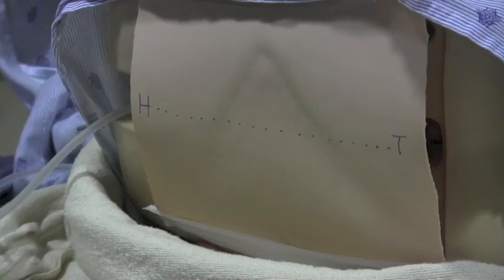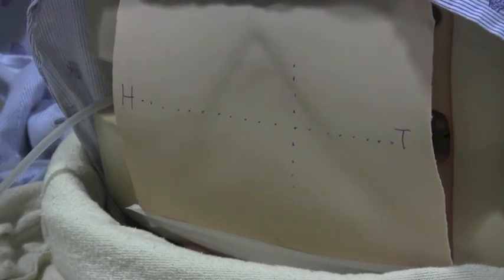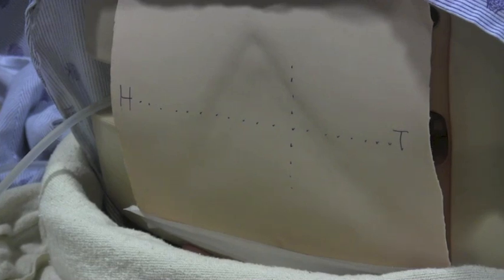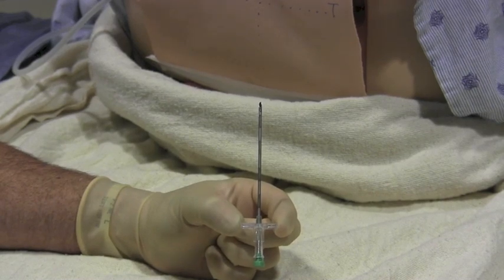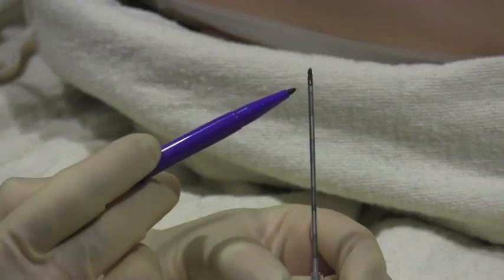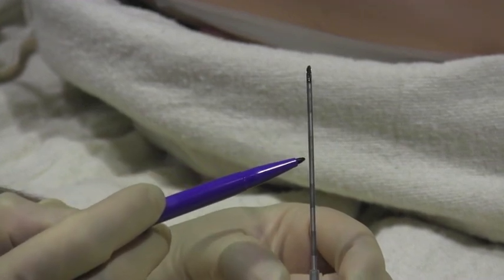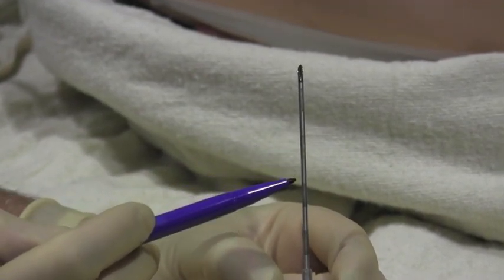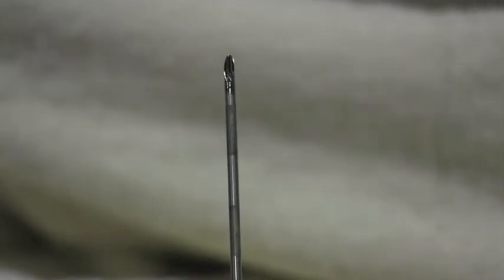Here's the back, marked head and tail, and the midline with dotted lines. The crosshair is at the L4-5 or L5-S1 interspace. Here is the needle that is going to be used to introduce the catheter. It has a beveled edge, and each mark represents 1 centimeter. Here's the beveled edge being shown.